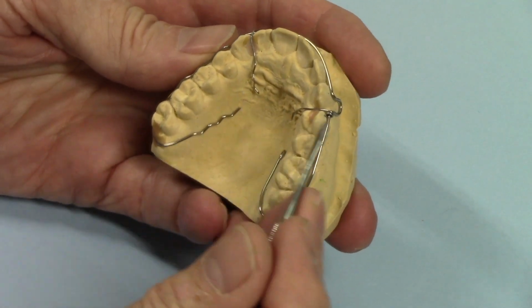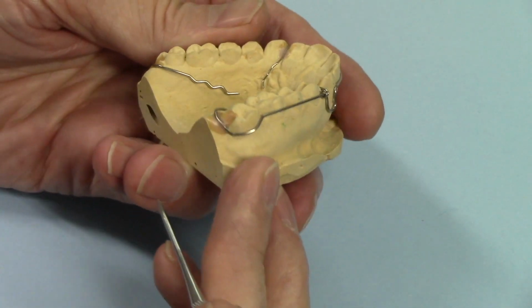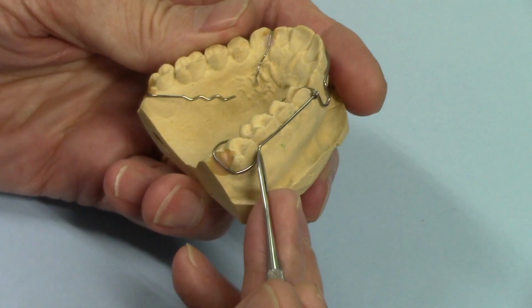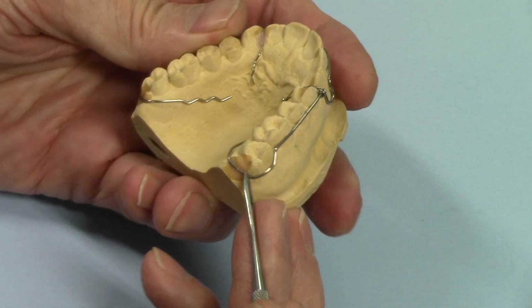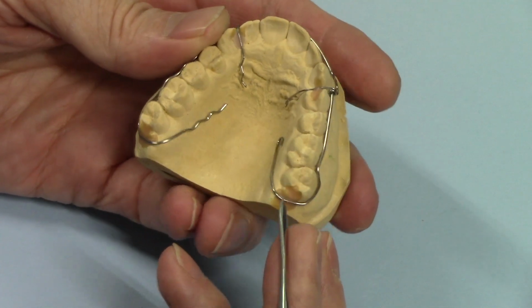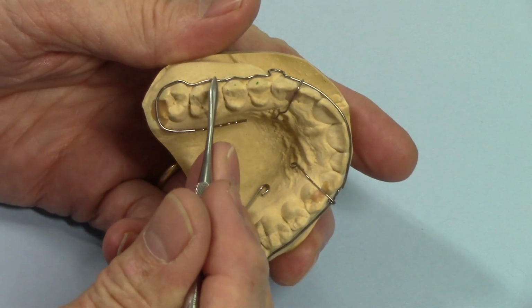So this labial bow can either be straight across the buccal like that one, and then it goes down toward the gingival margin on the second molar to get like a C-clasp retentive value back here. You can be fancy, you can have it festooned like this.